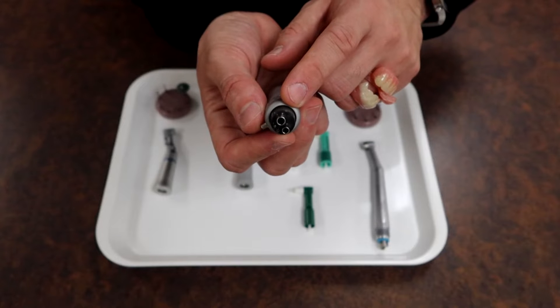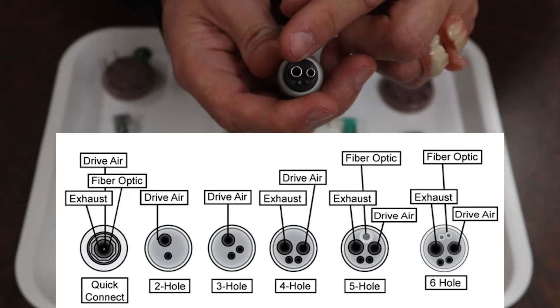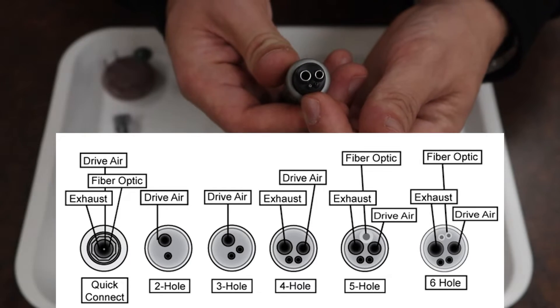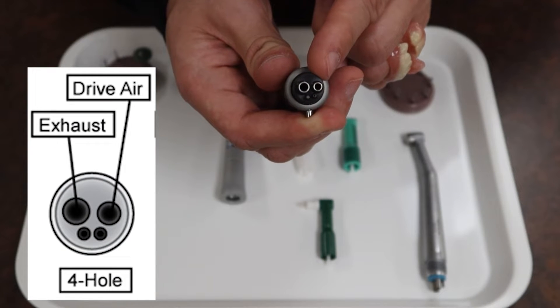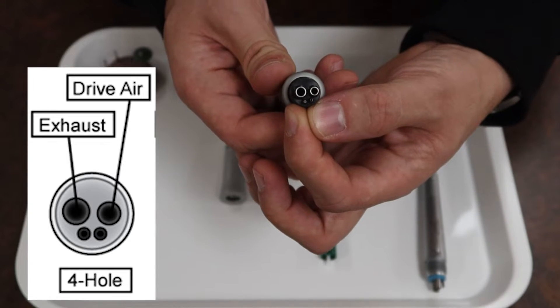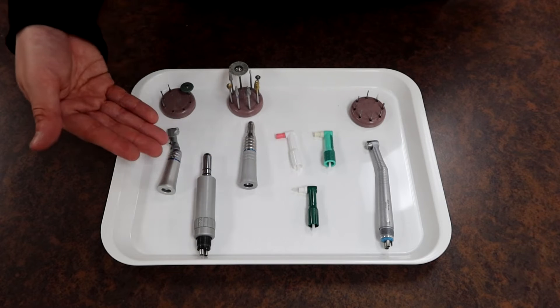At the bottom of the slow speed motor you're going to find some ports, and you'll commonly find these on many different handpieces. You'll potentially have a larger one, a medium size, and two small ones on the side. The larger one is your air exhaust, the middle one is your air intake, and the two small nozzles at the lower end are for your water intake.